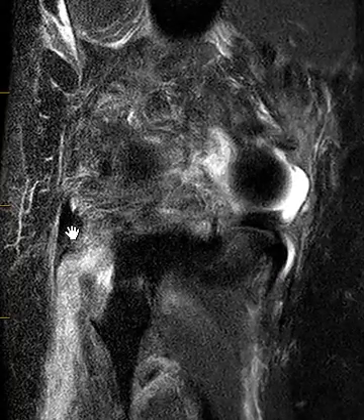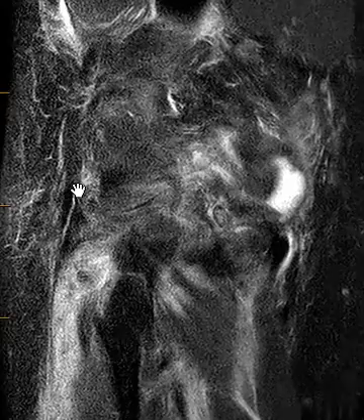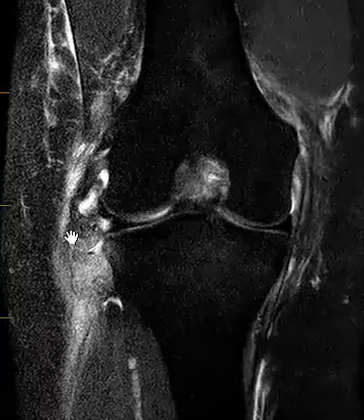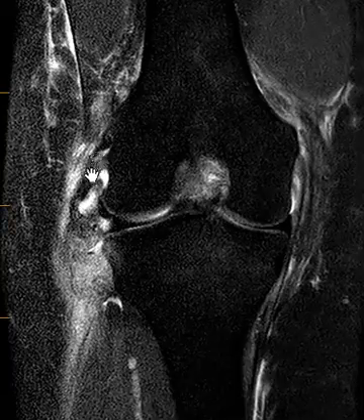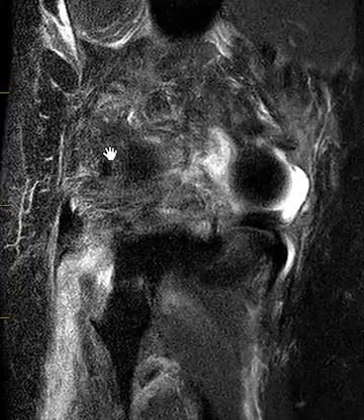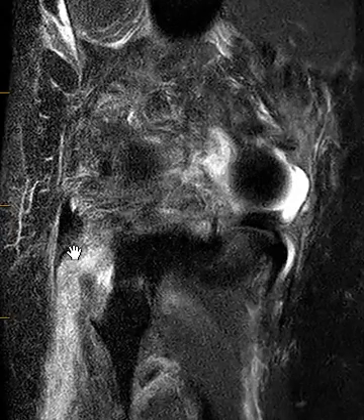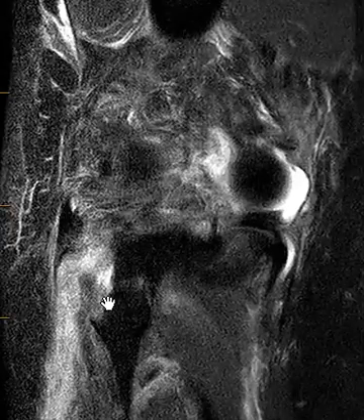We can see here this little dark band is the conjoined tendon, and this is the biceps that comes down to form part of the conjoined tendon. This is the fibular collateral ligament that comes over here to join. So we do have intact biceps, intact fibular collateral ligament, and intact conjoined tendon — but the problem here is just that fracture from the fibula that allows it to distract proximally.